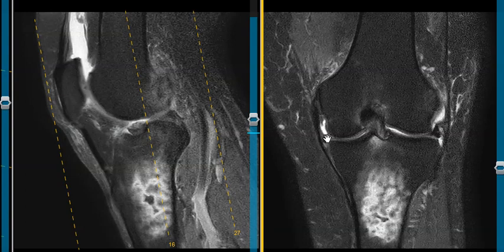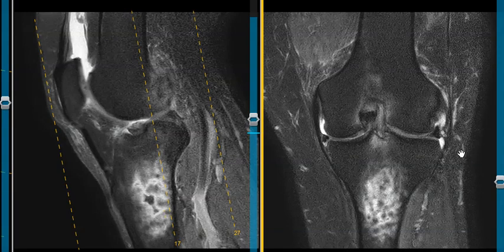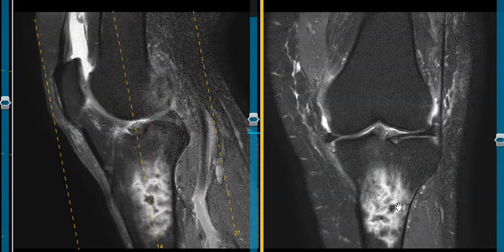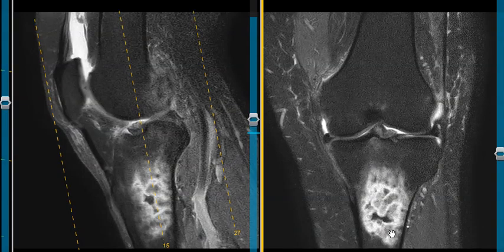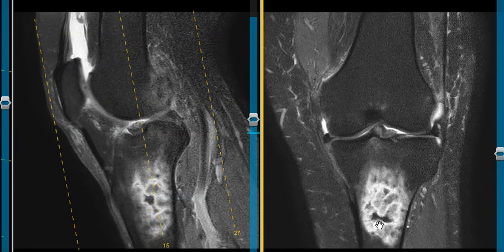We see a medial meniscus — the meniscus is torn actually here. Here's the lateral side, and we see this big bone lesion in the tibia. This is the metaphysis, and down here is the diaphysis, so it's kind of a metadiaphyseal lesion.